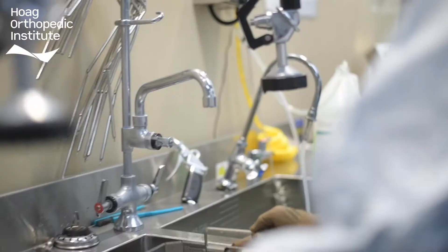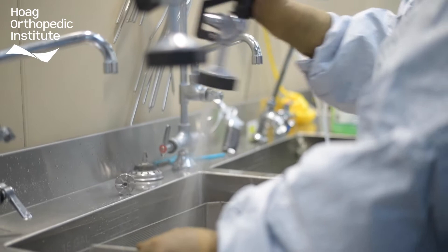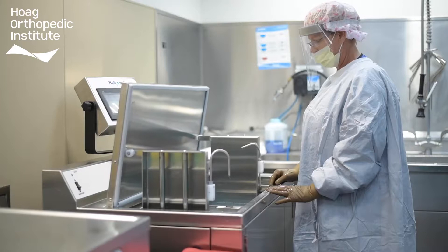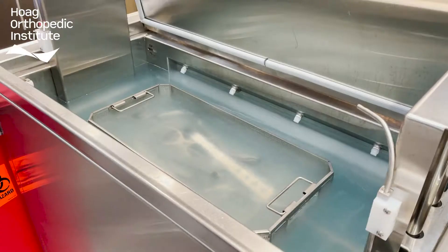Once all the bio-burden has been removed, the instruments are rinsed and moved on to the next step of the process: ultrasonic cleaning. It is in this process that the remaining biofilm that cannot be seen by the human eye is removed. An ultrasonic cleaner works by sending ultrasonic waves through the water. These waves create tiny unstable bubbles that, when in contact with the instruments, implode and remove the residual biofilm.